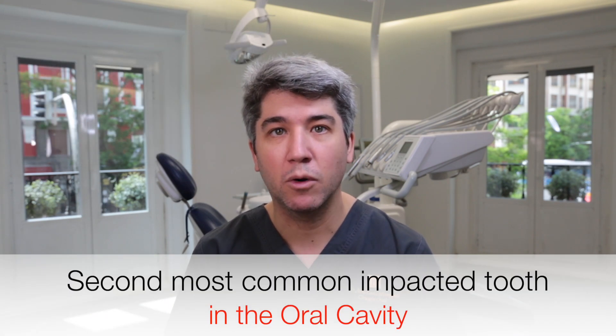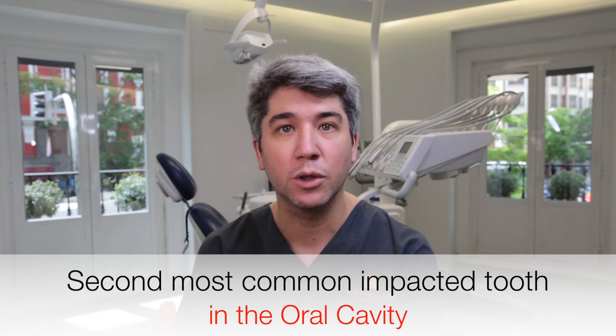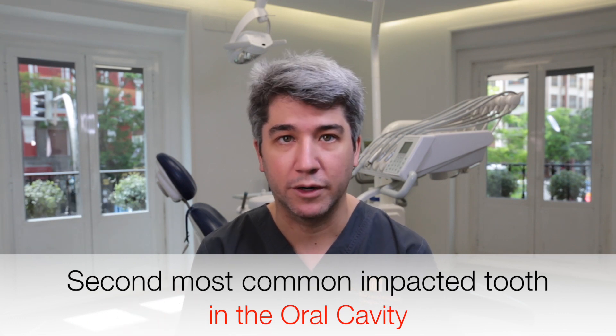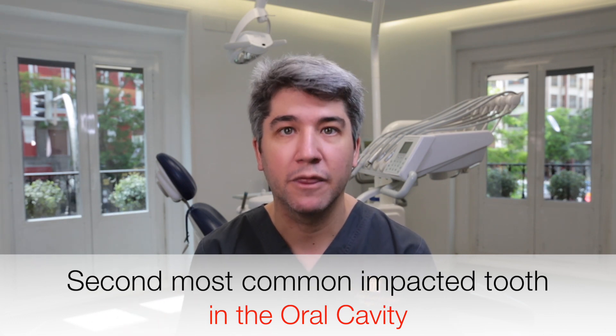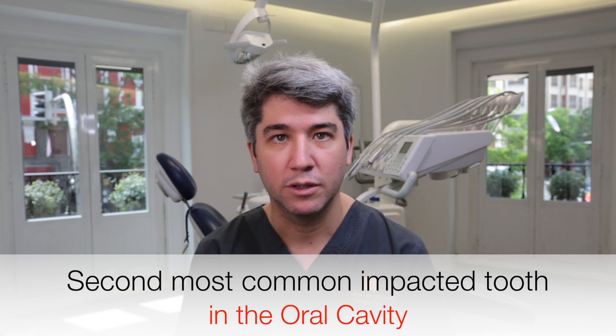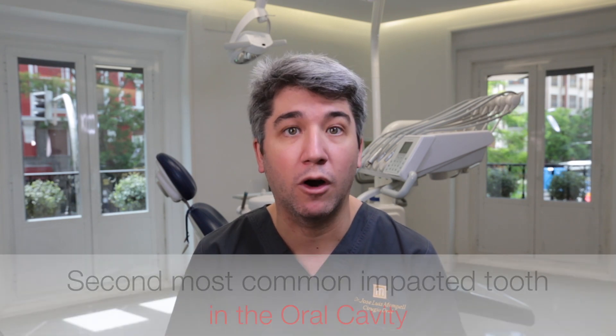The impacted canines are the second most common impacted tooth in the oral cavity, right after the wisdom tooth. That's why it's absolutely mandatory for all of us dedicated to oral surgery and implantology to know how to deal with these kinds of situations.